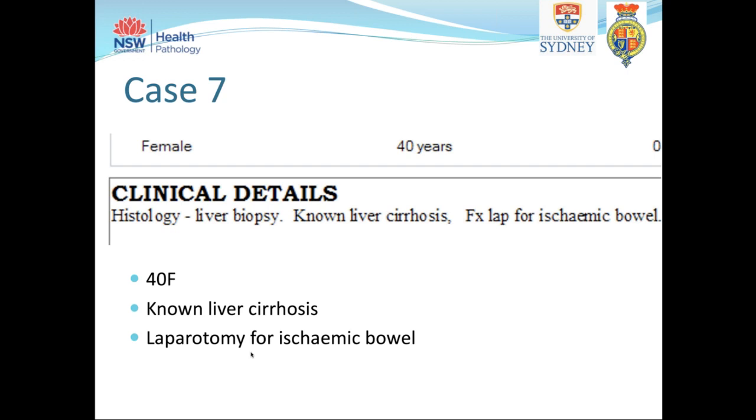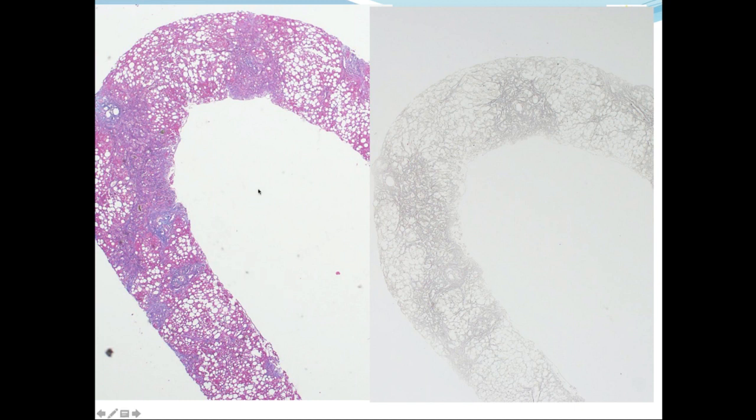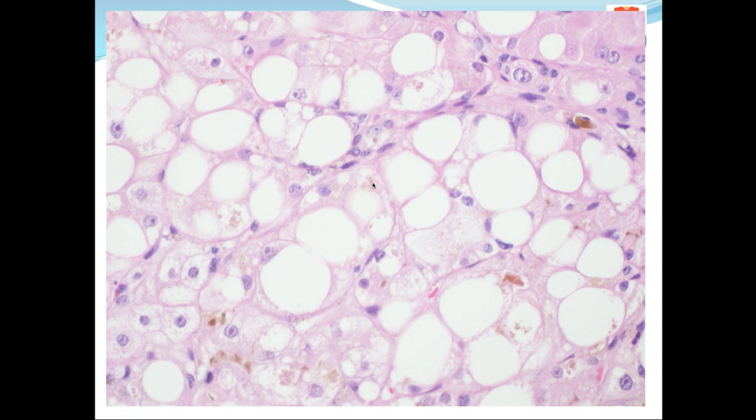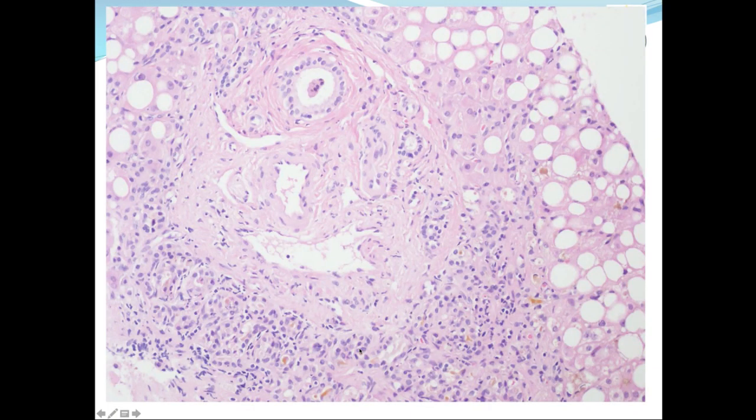So this next case is again an unusual variant of fat in the liver. Again, a bit of a sketchy clinical history, 40-year-old with known cirrhosis, we're told. At low power, you can see it's a bit of an unusual pattern of fibrosis here on the reticulin and trichrome, with this irregular pattern seen. On higher power, she's obviously steatotic, and you can see a bit of action around the portal tracts, which I'll focus on shortly. So marked steatosis, as well as some ballooning and quite pronounced cholestasis.